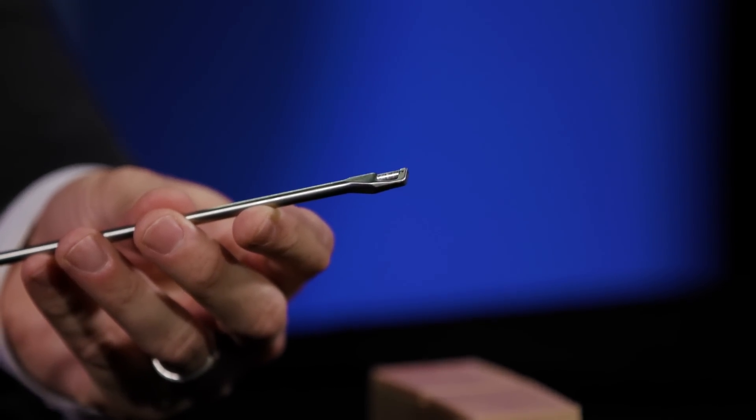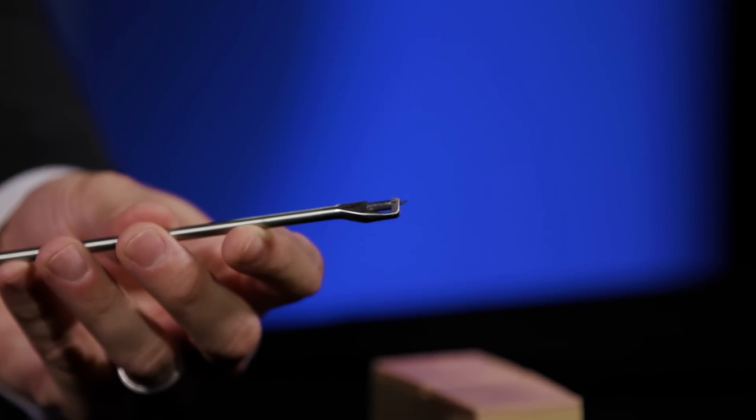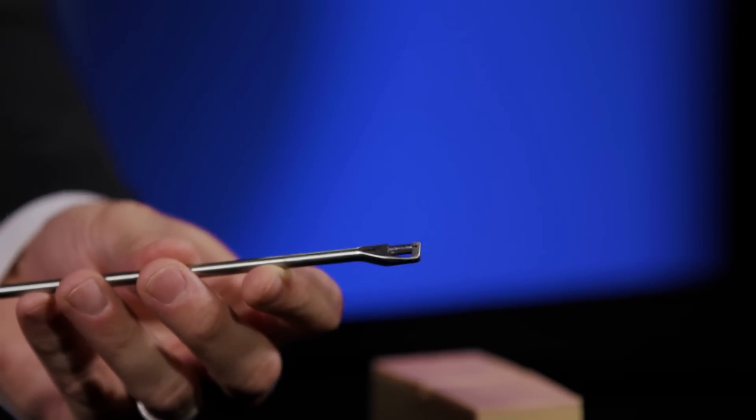There's a compressive feature that allows you to compress your capsular tissue before you take your bite of tissue. Once you're happy with the amount of bite you've achieved, you'll simply squeeze the back of your handle to push the needle through the distal jaw to capture your suture.